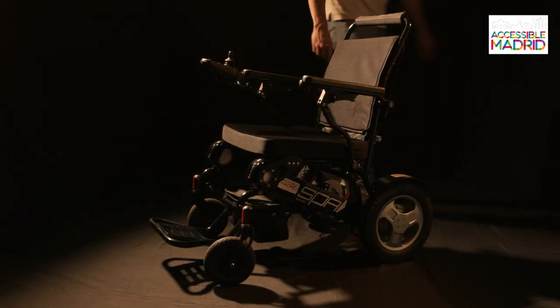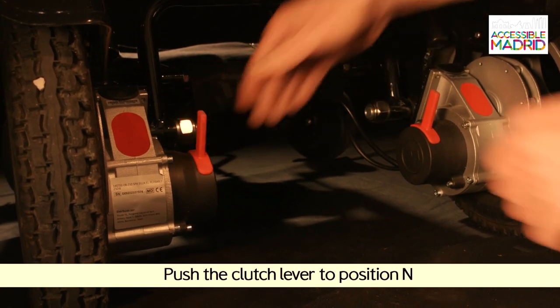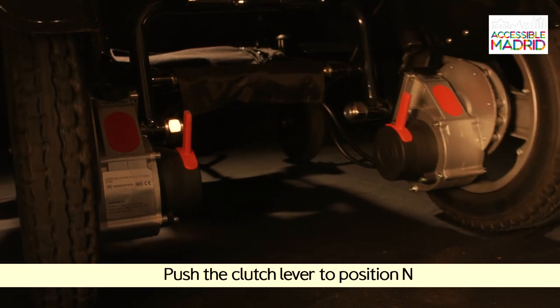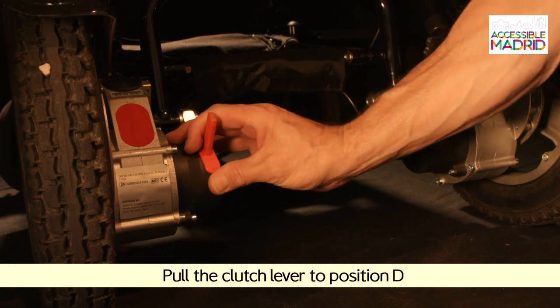The clutches have two positions: Neutral, in which the chair can be moved manually, and Direct, which blocks the chair for electrical use.